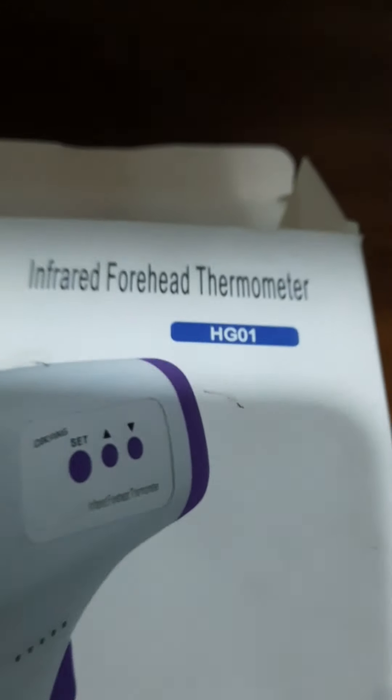We will open it. Here is the invoice and the H601. There is the H601 thermometer. We can do the thermometer.